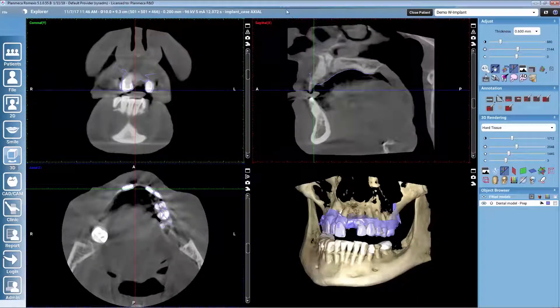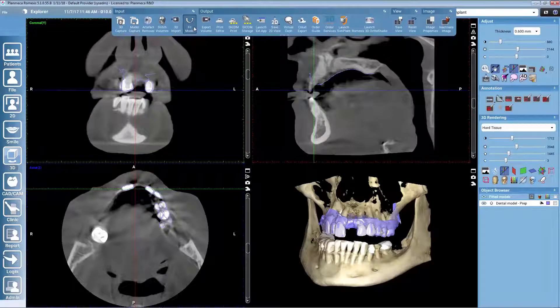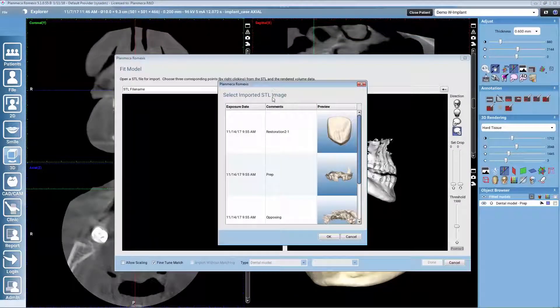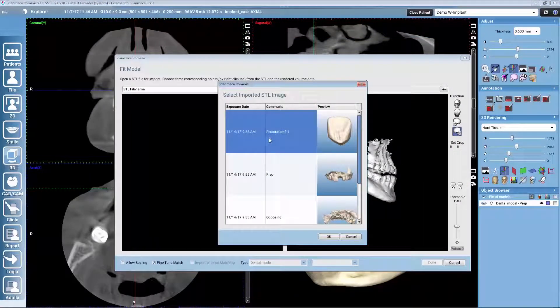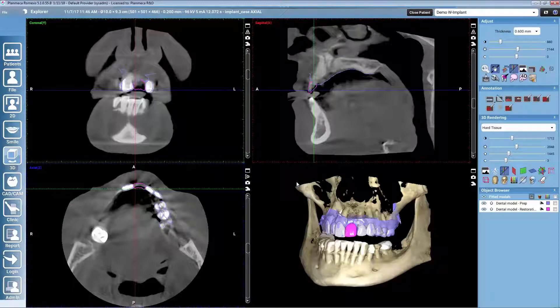After that, if we have also made a restoration design already, we can match that to the volume as well with the same fit model tool. Romexis notices that this crown has been designed on top of the already matched intraoral scan, so the crown will drop automatically to the correct place.